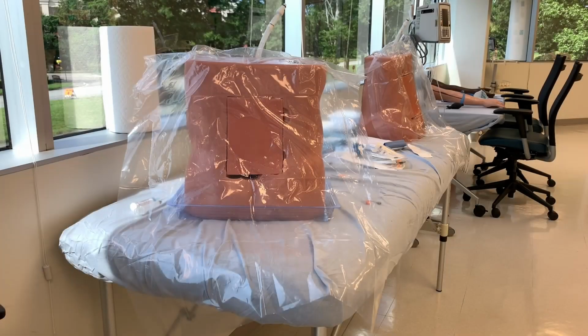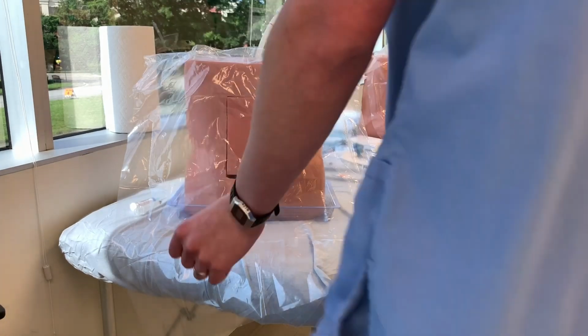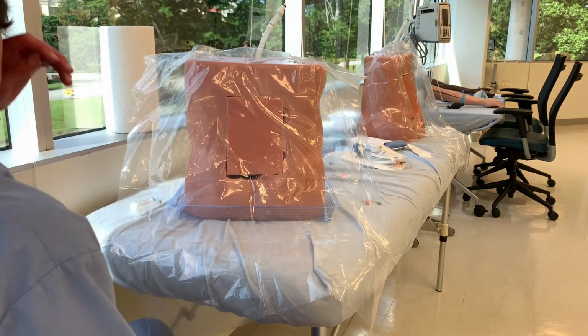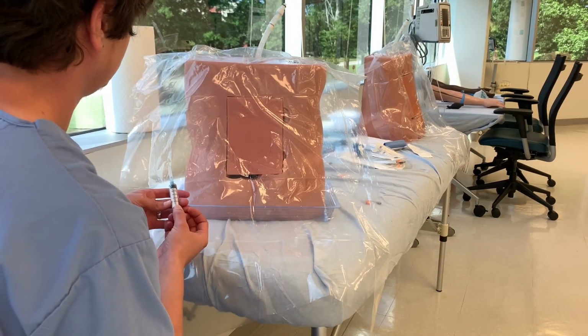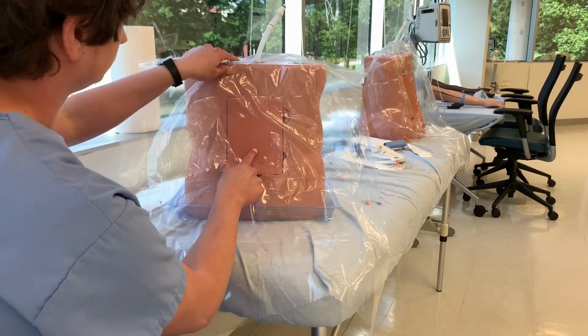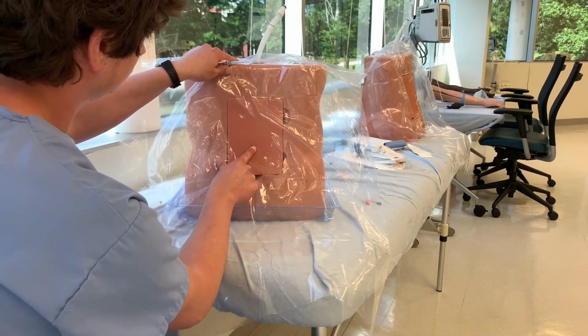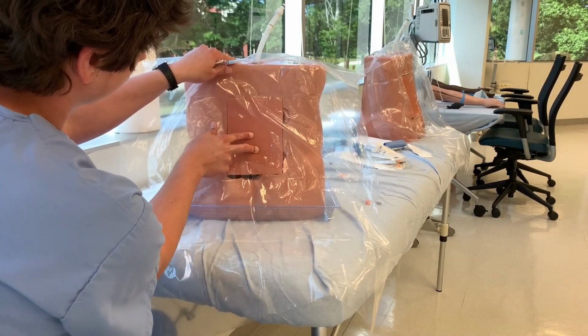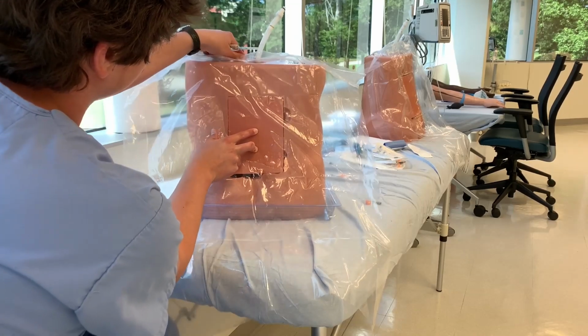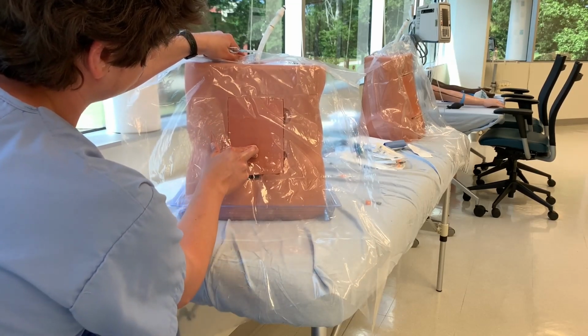Now we're moving on to spinals, aka the big needle. And spinals and epidurals are the things that I have the least practice with, so you just have to bear with me. So to begin with, we're going to take some fake local anesthetic, palpate our landmarks. We're going to numb the skin, and then we're going to numb the path of the spinal needle.